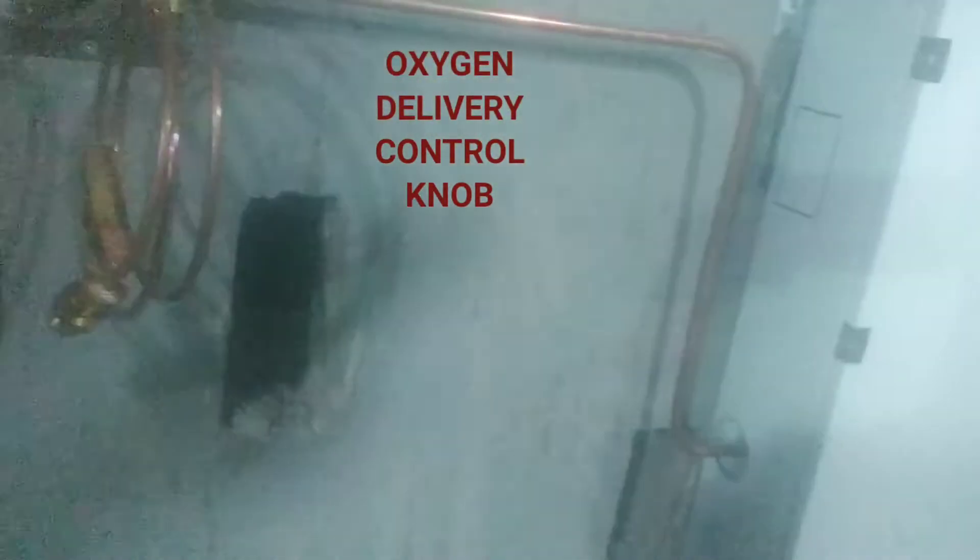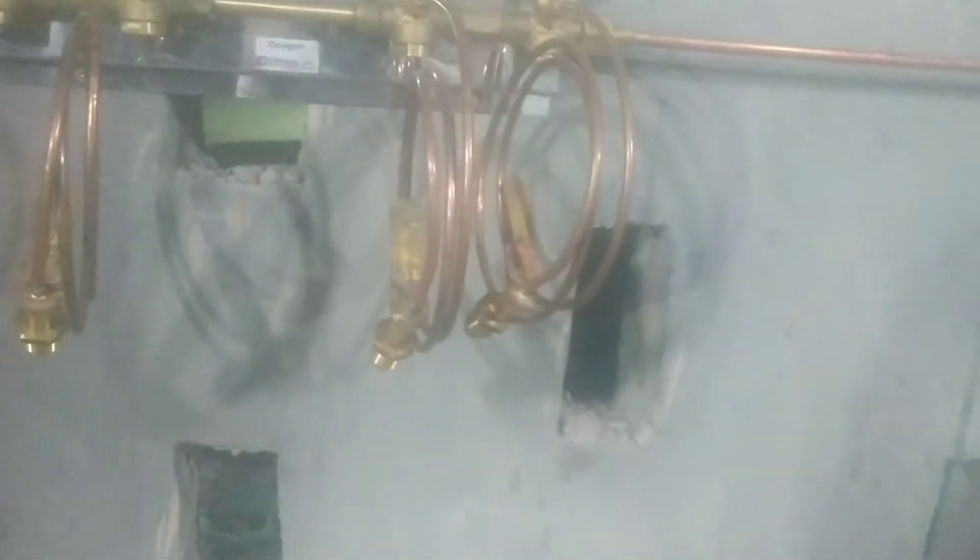This is where we fix the oxygen cylinders, and we use it to strap them to prevent falling or movement when delivering the oxygen.